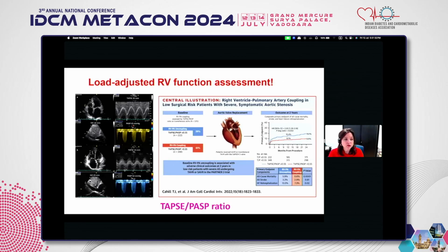And a pretty simple way of doing it is just using the TAPSE, or maybe just substituting the TAPSE with the strain and correcting for your pressure measurement. So in that case, you can really assess if the balance of the right heart is good or not. And I really suggest some nice reviews to look at how to do that.